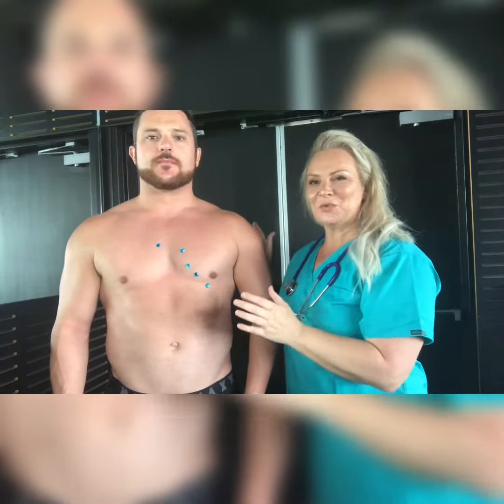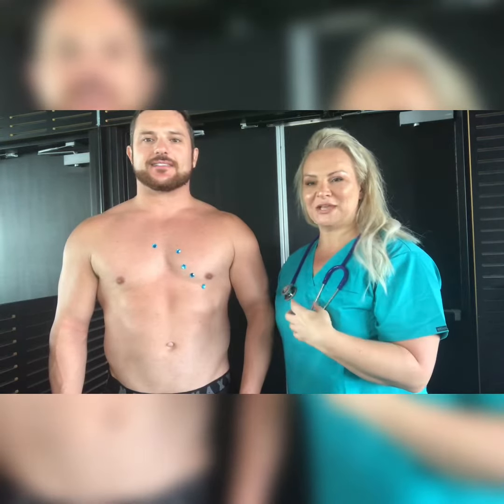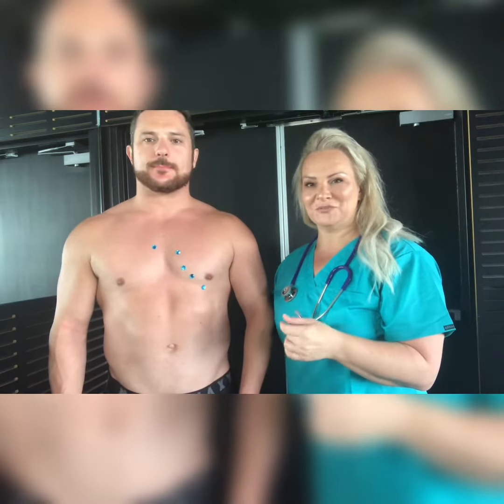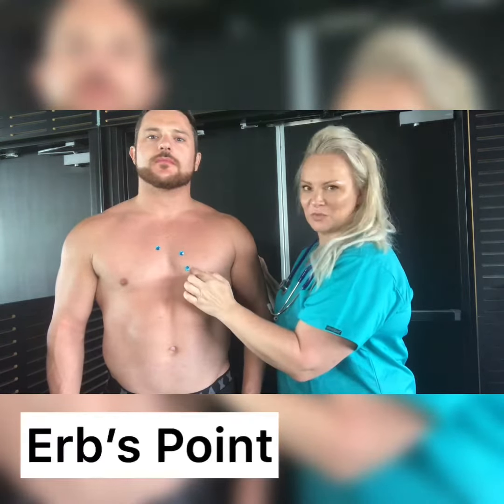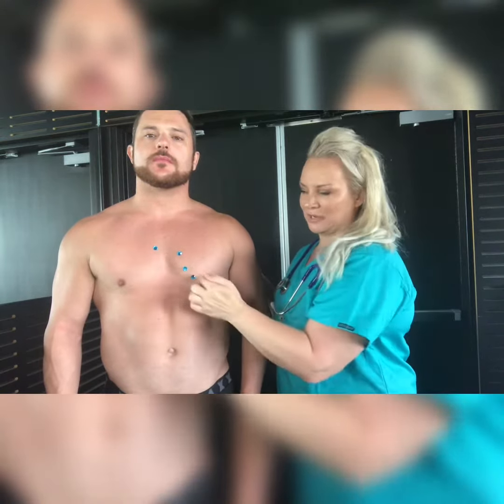We've got an anatomical model here today to show us how to auscultate heart sounds. One of the mnemonics I learned in my training was 'All Pigs Eat Too Much,' which stands for Aortic, Pulmonic, Erb's point, Tricuspid, and Mitral valve. When you auscultate each of these, you'll hear each of those valves.